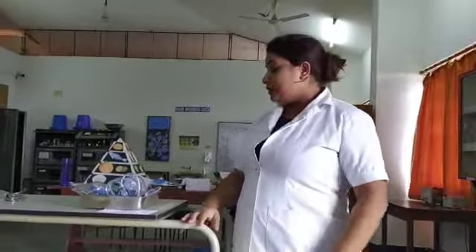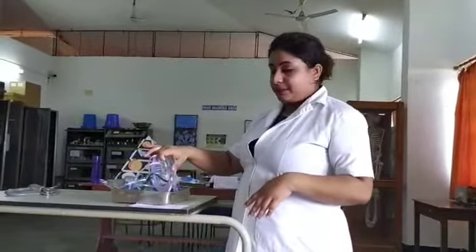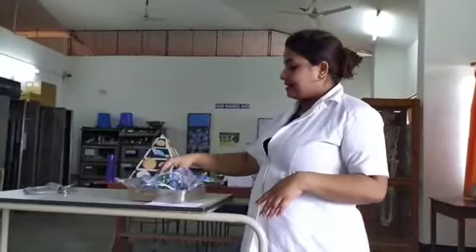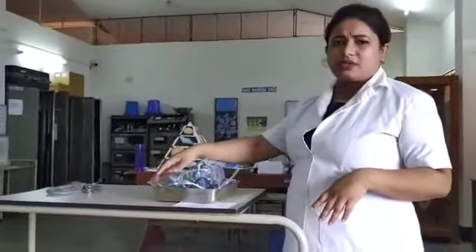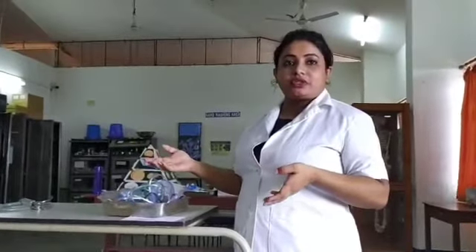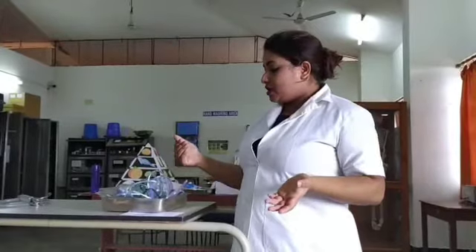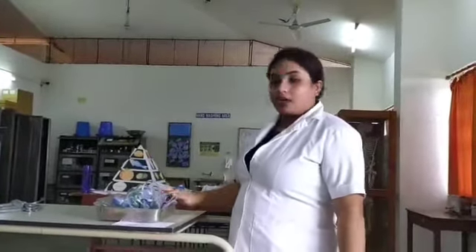The tray should contain an Oxygen Mask, nasal prongs, and a Pulse Oximeter, which is very important to check SpO2 during and after giving oxygen, to check the oxygen saturation in the patient's body. We also need a gauze piece to wipe the Oxygen Mask before putting it on the patient.